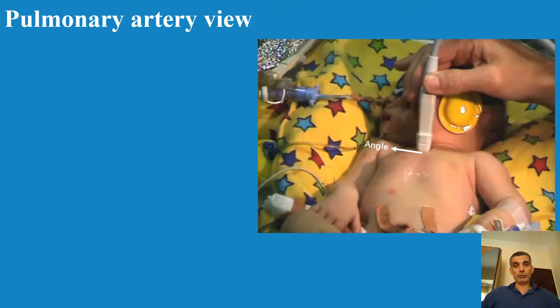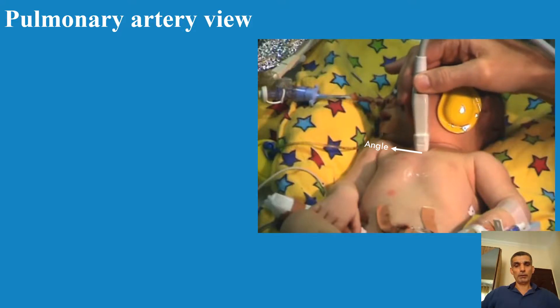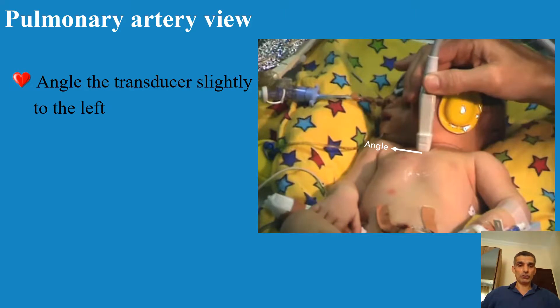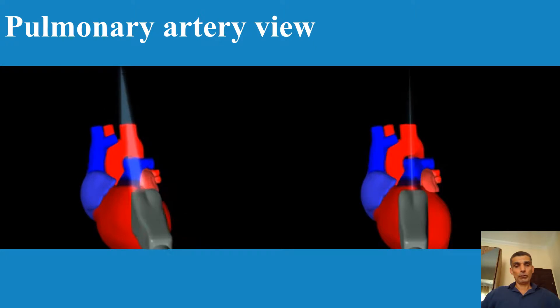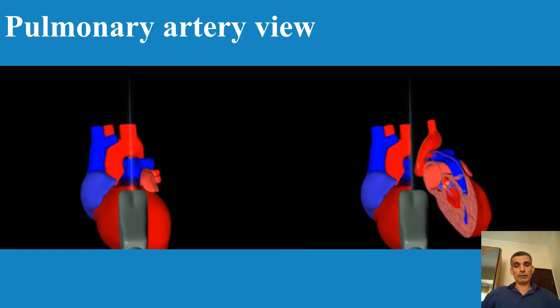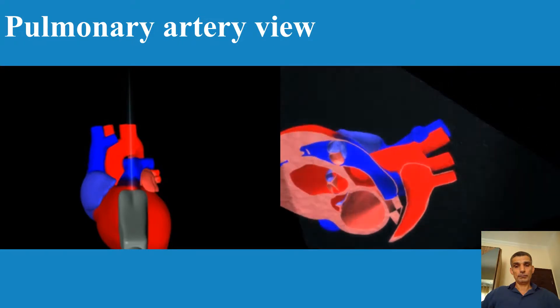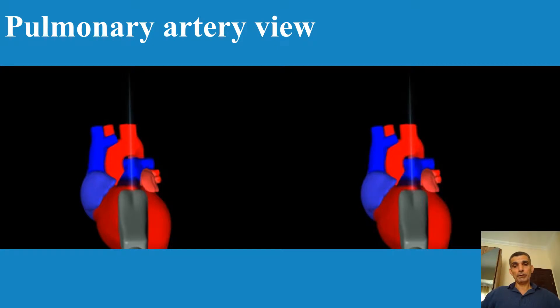For the pulmonary artery view, same position, but you angulate to the right side to see more to the left — a very small movement, barely visible. You move the transducer to the right to angulate the beam slightly to the left. The ascending aorta will disappear and the main pulmonary artery will appear. You can then see the right ventricle, the pulmonary valve, the main pulmonary artery, the left atria, and possibly the mitral valve and left ventricle, as well as part of the descending aorta.